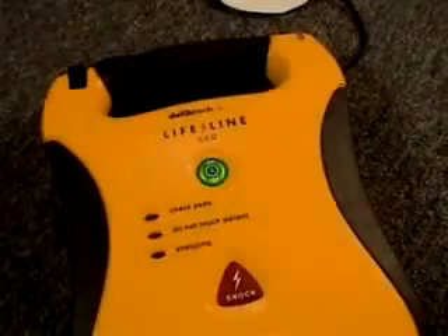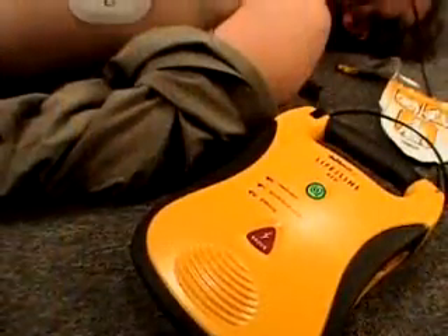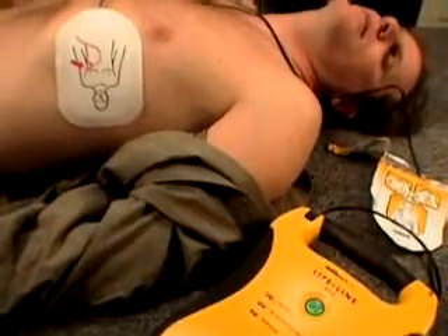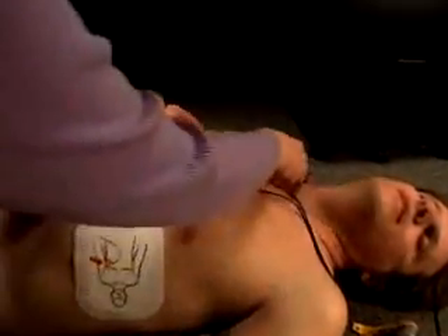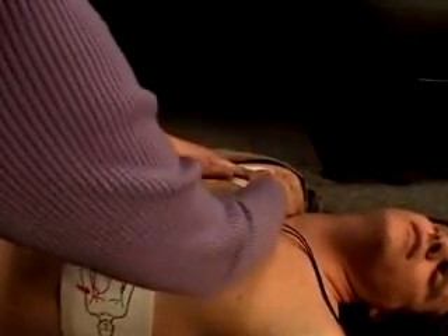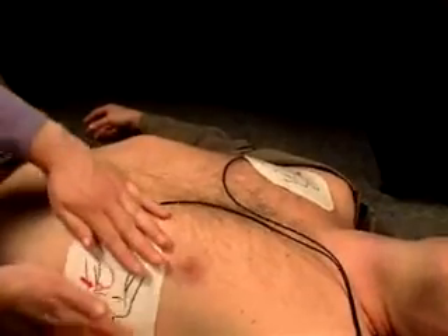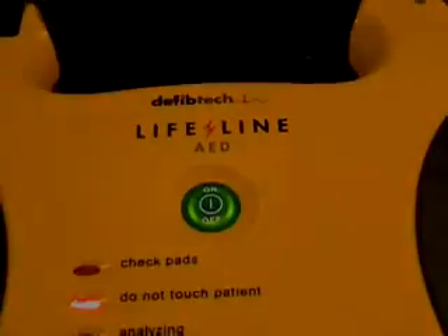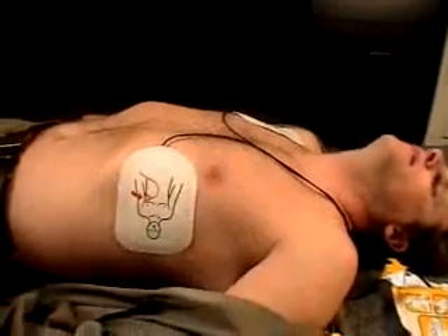For pad contact to patient, press pads firmly. The unit automatically checks the connection of the pads to the victim and lets you know if the connection is bad. Make sure the pads are properly attached to the victim and not touching each other. If needed, reposition the pads and dry or shave the victim's chest. Stop motion — the unit will not analyze the victim's heart rhythm if it detects the victim is being moved. Stop motion and do not touch the victim if so instructed.